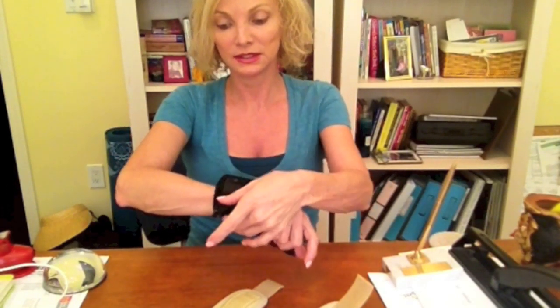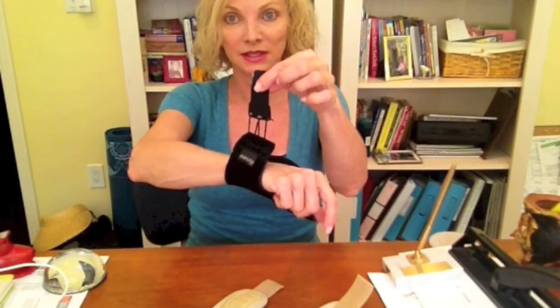I got these at CVS. They were not covered under my insurance, but they are a heavier support, heavier material. I find I sleep in these and they really support my thumb well. They just slide right on — they come in small, medium, large. There's also a thumb Velcro piece that you can tighten. What's really cool is they have laces on them and one piece of Velcro that wraps around your wrist. They cover a bit more of my wrist than the first ones and give a lot more support, which is great. I wear them mostly at night.